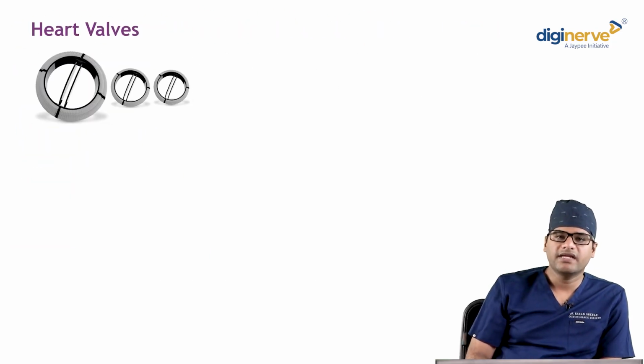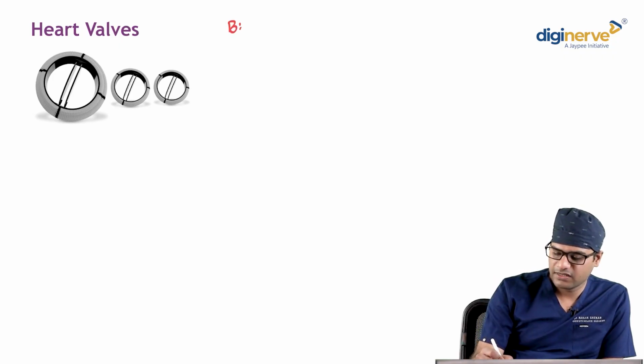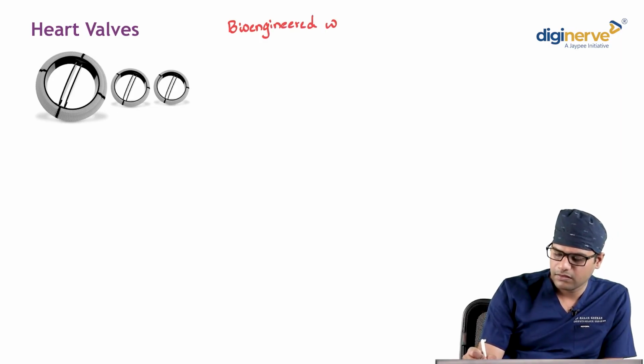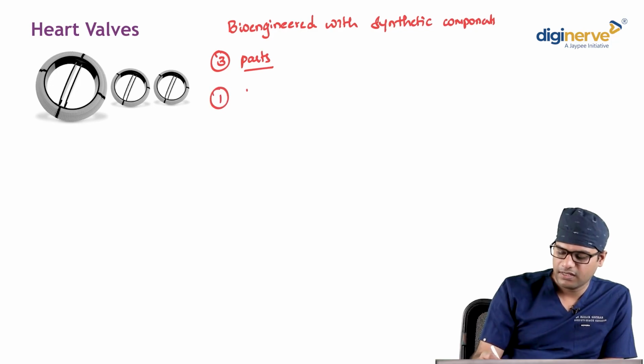So the mechanical valves are those valves bioengineered with synthetic components. There are three important parts of a valve. One, the disc of the valve.